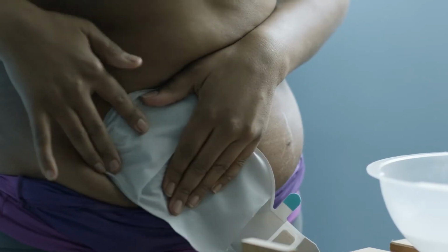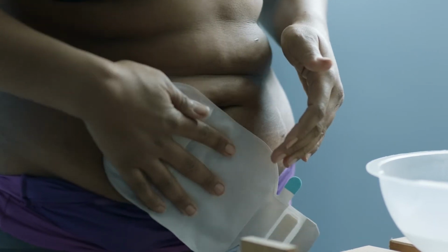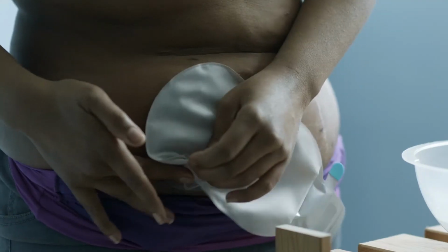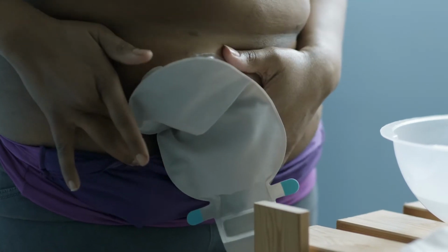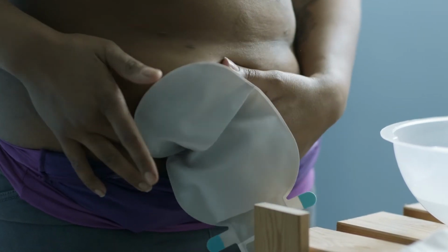I would recommend most new users do their change in front of a mirror. Really get to know your body, get to know what your ostomy looks like, because that way, if you have any changes, you'll see them immediately. Once you've been doing it for a while, you could change your ostomy bag in the dark, no problem. But to begin with, do it in front of a mirror. It's really, really helpful.